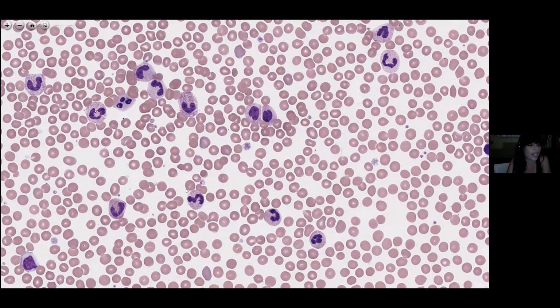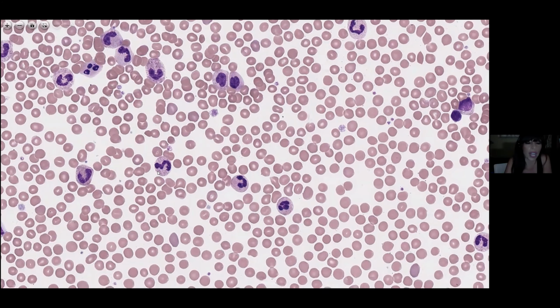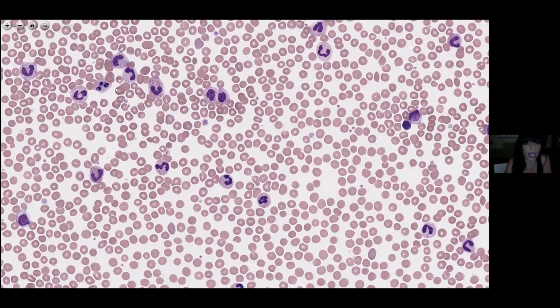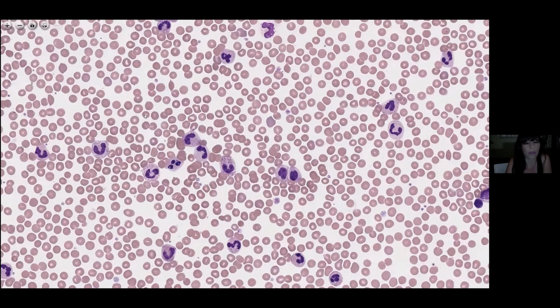For this case, there's no dysplastic features. As a clinician, I guess they could do further studies. There are additional cytogenetic tests available, and I saw in our laboratory when they suspect any of the myeloproliferative neoplasms at all, they can order a panel that includes the colony stimulating factor 3.